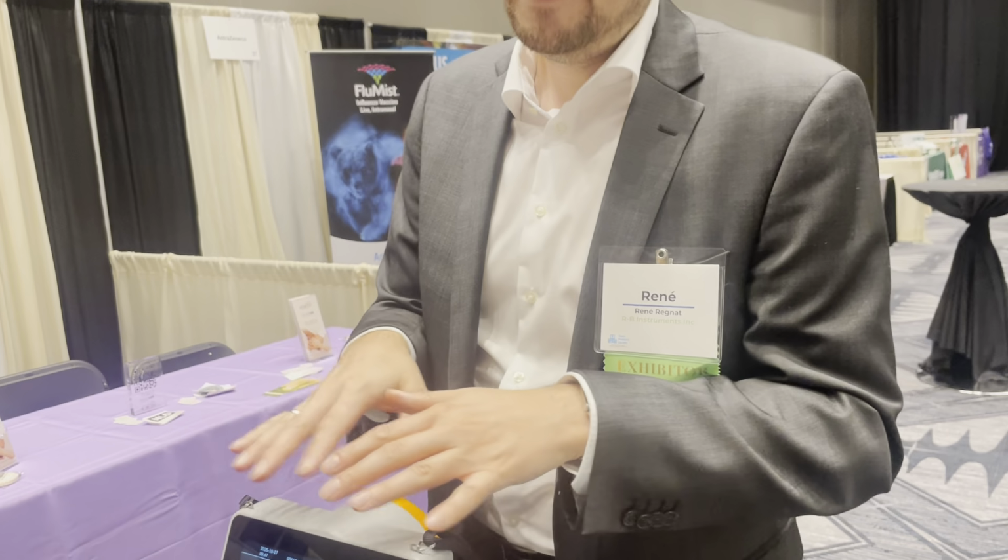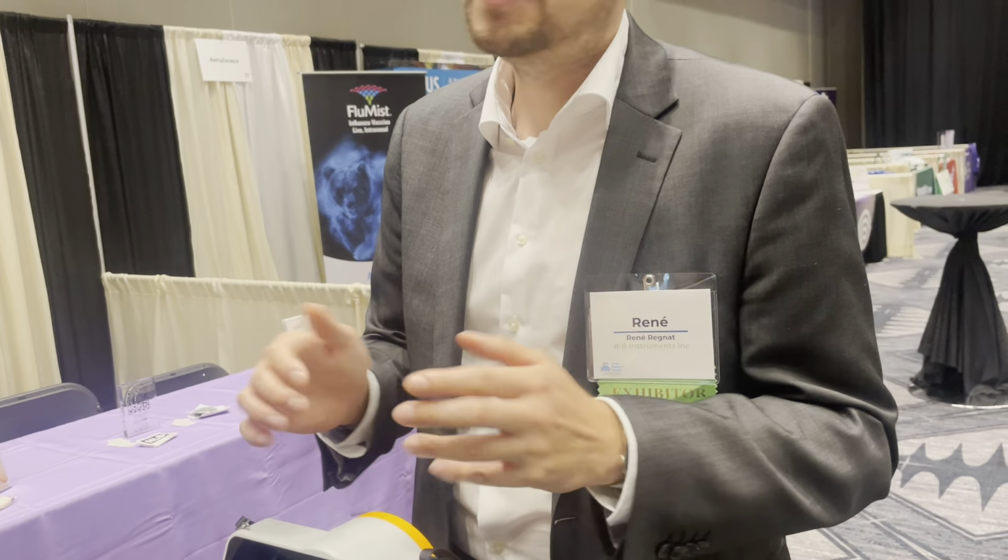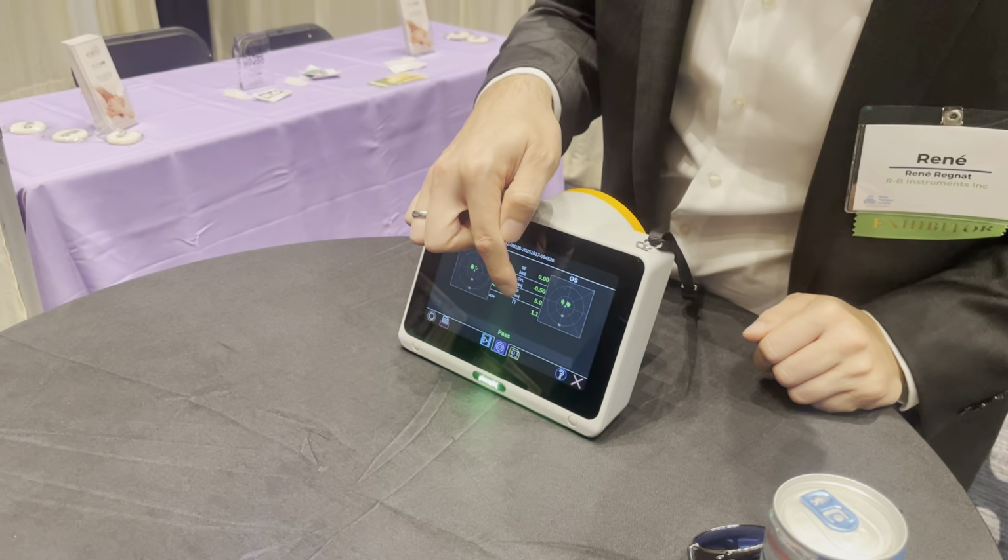We display it manufacturer setting as minus. You could change it to plus. Doesn't make a difference for you. It's for optometrists in the end. Keep it on minus. Pupil sizes. This is where we could see anisocoria. Like I said, could come from trauma or concussion, or someone's born with it. And then ASY is the asymmetry.